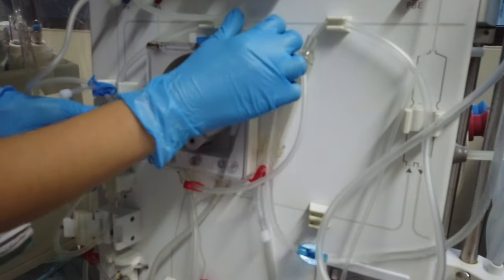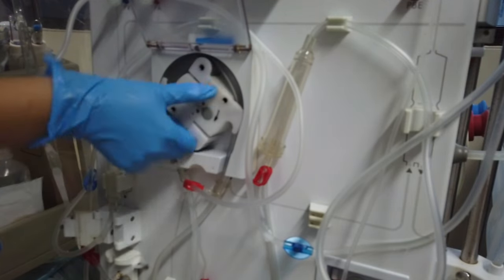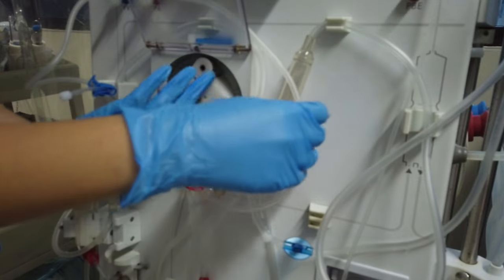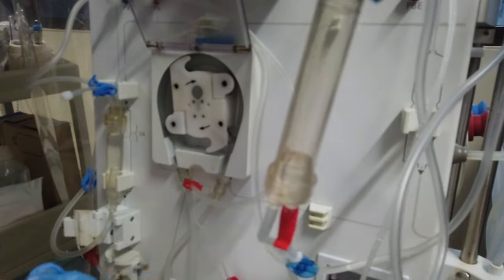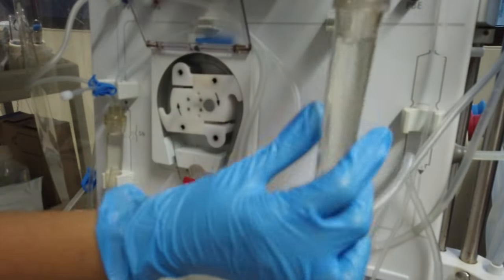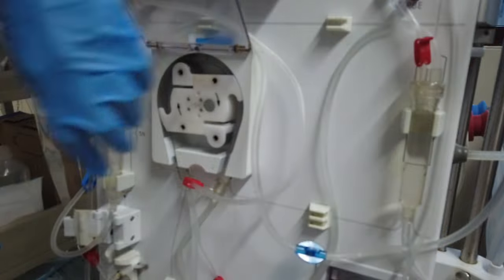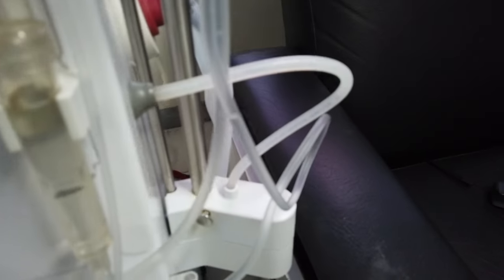For the arterial line, you can actually prime it even if the machine is not turned on. Open the pump cover and turn the blood pump manually by using your hand or using a hand crank. The reason why the arterial chamber is placed in a reversed manner is to expel air while the saline is filling the chamber. Once it reaches half of the chamber, turn it into its proper placement and place it onto the holder. Stop the blood pump once the saline reaches the arterial dialyzer end.